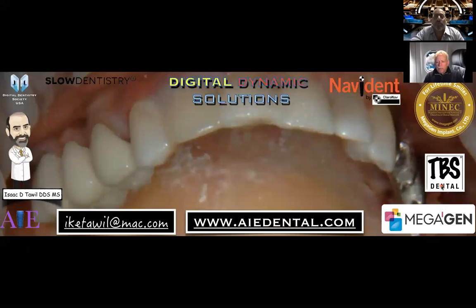But they are doable, they are possible. It's not a case I would start with, but certainly ones that we do quite often in the practice here. We've been doing socket shield, partial extraction, for 8 years, and it's become commonplace for us. Those are actually now my favorite cases, because I'm usually thinking immediate load same day.